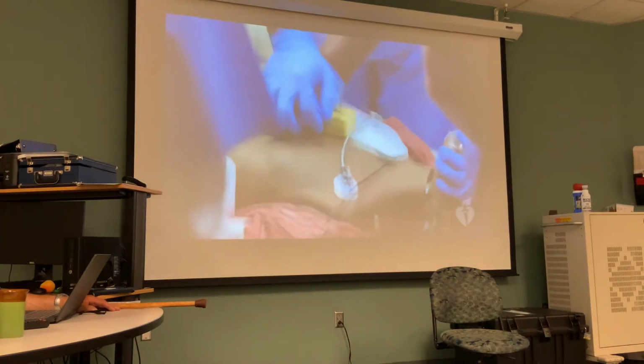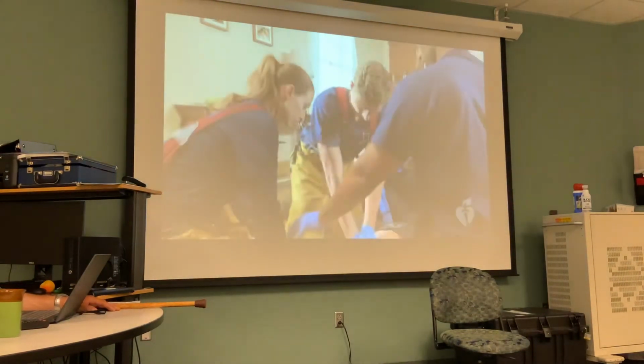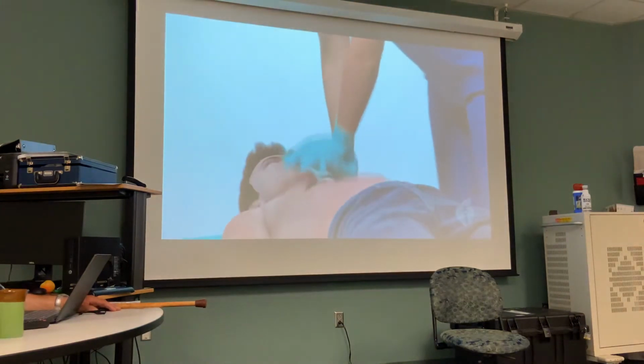The AHA requires the use of audio-visual feedback and prompt devices during training, practice, and testing, and highly recommends their use during real emergencies for real-time monitoring of CPR quality. The first skill we'll demonstrate is performing continuous chest compressions for 2 minutes.